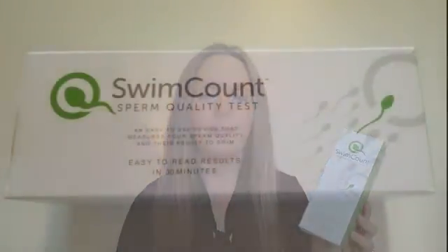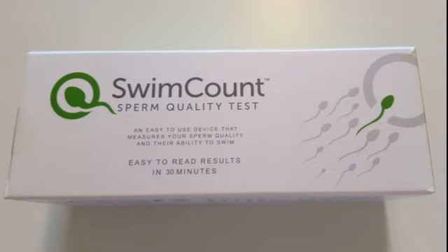Today in this video I'm going to show you the product, I'm going to show you how to use it, and then I'm going to give you my professional opinion on the product and who I think this product is suitable for. So now let's take a look at the product.